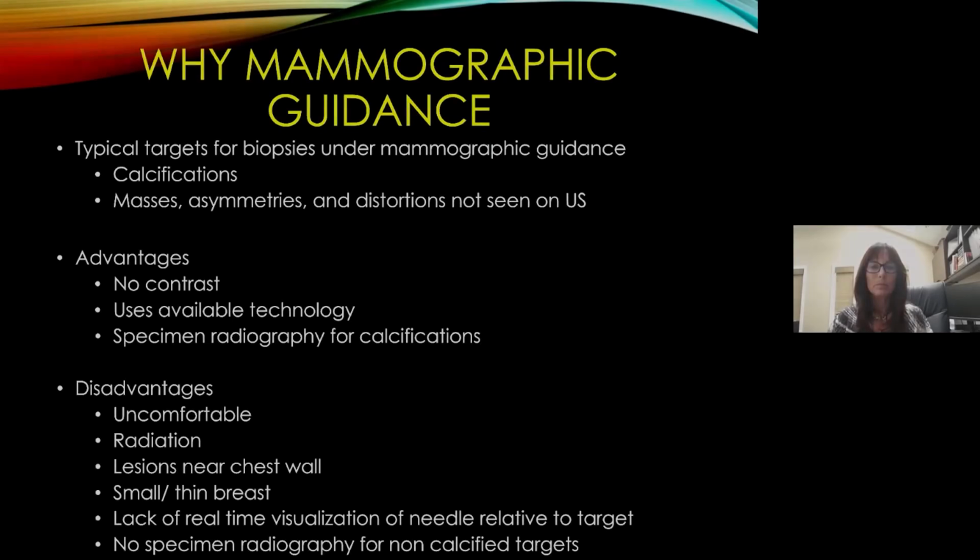Why would we specifically use mammographic guidance rather than ultrasound or MRI guidance? Well, there are findings that are solely seen on mammography. Typically, these are calcifications. However, there are some masses, asymmetries, and distortions that are sonographically occult. And so we default to using mammography for guidance of the percutaneous biopsy.